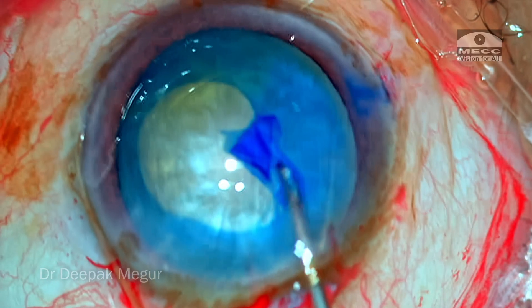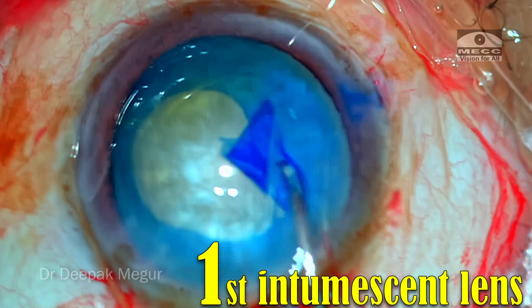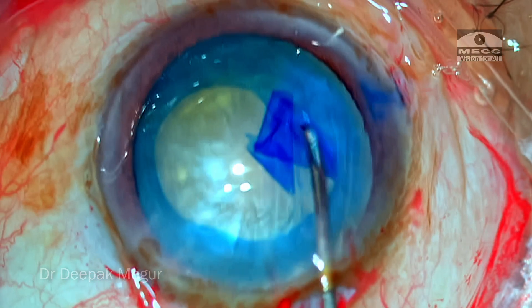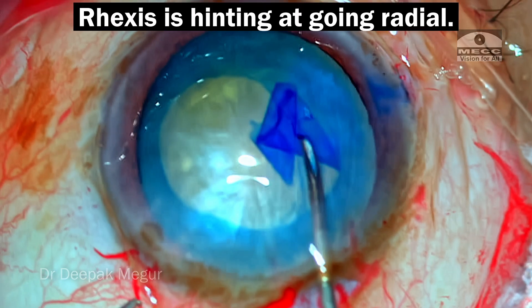So let's begin. Here is a young trainee surgeon who is attempting rhexis in his first intumescent lens. The rhexis is halfway done — so far, so good. As the rhexis is moving along, the rhexis is hinting; it's trying to run away.